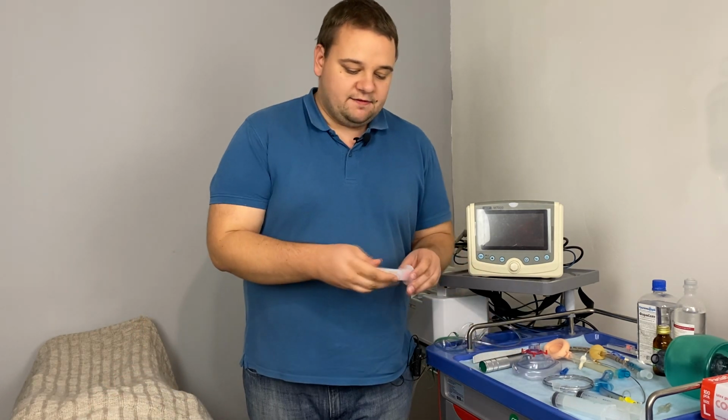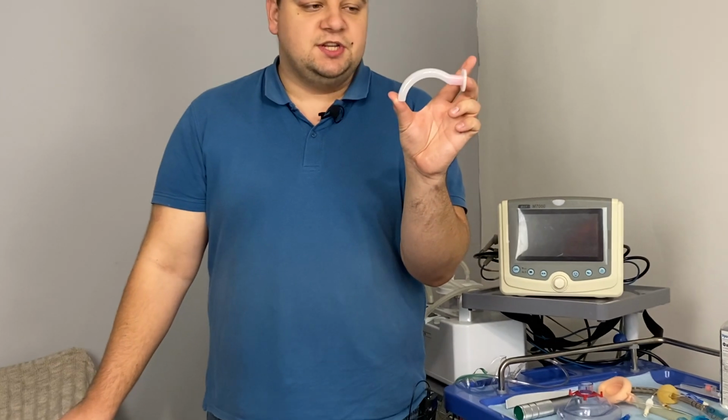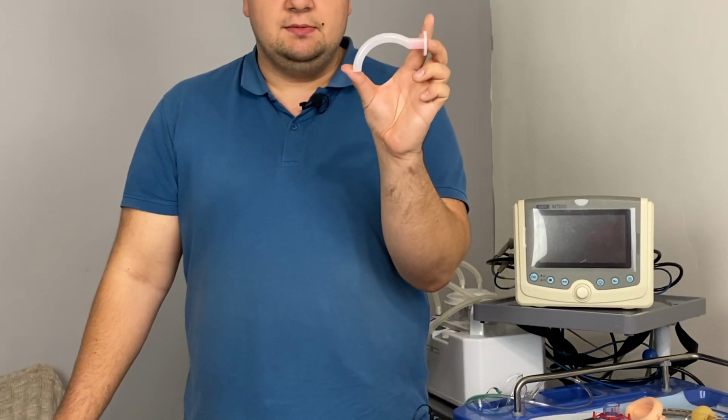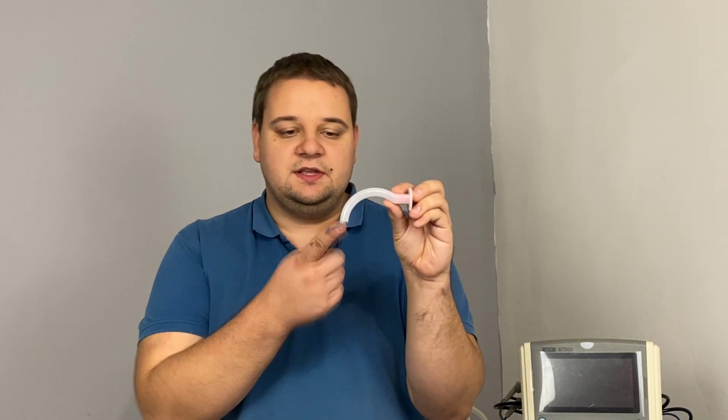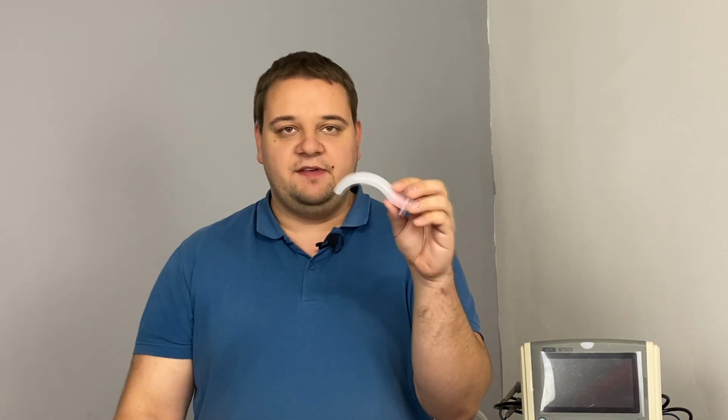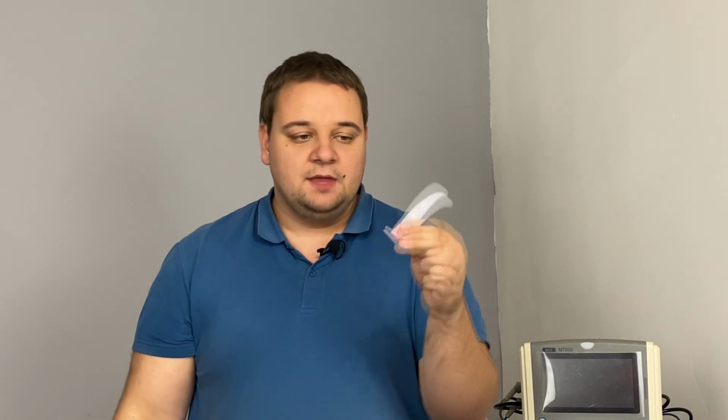Firstly, I will show you all the devices, and then we will look at the patient to see how we install them. First of all, we have this oropharyngeal tube, or S-type tube, depending on the language generally. The scientific name is oropharyngeal tube. According to the name, this one is installed inside the mouth of the patient, and when it is installed, the inside end of the device will press the tongue, so it will prevent the tongue from slipping. And as you can see, there is an empty part inside, so the air will also come through this tube.